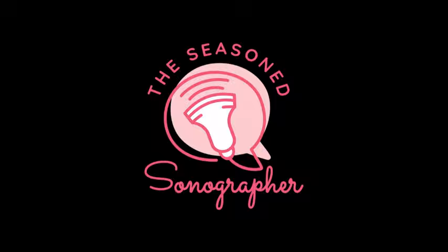So when placental insufficiency develops, what is happening physiologically? It's something within the vessels in that placenta. Usually they can have vasoconstriction, or they're just not as well developed. And we use umbilical artery Doppler to assess that blood flow from the fetus to the placenta, and that waveform reflects how hard the fetus has to push that blood through the placenta.